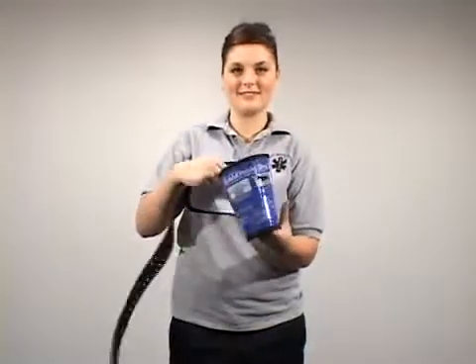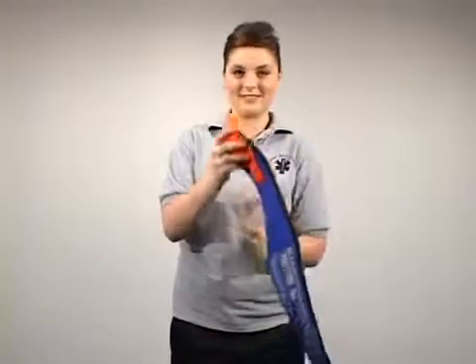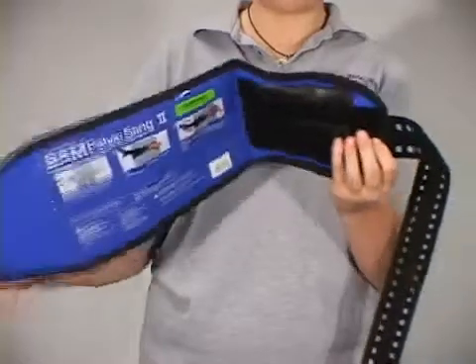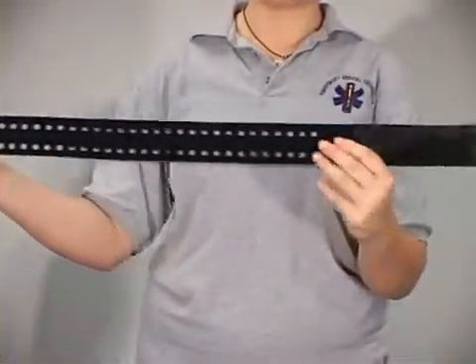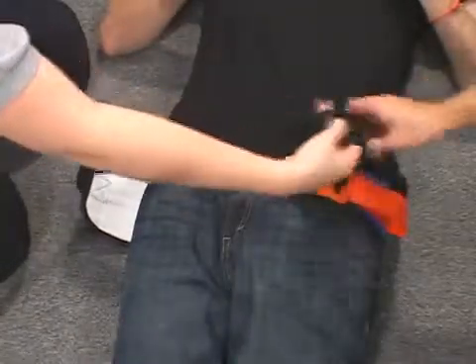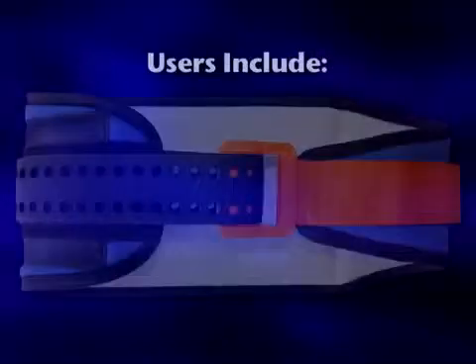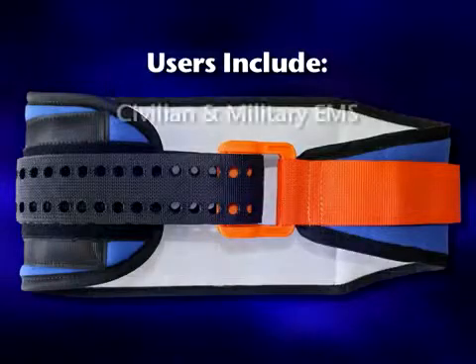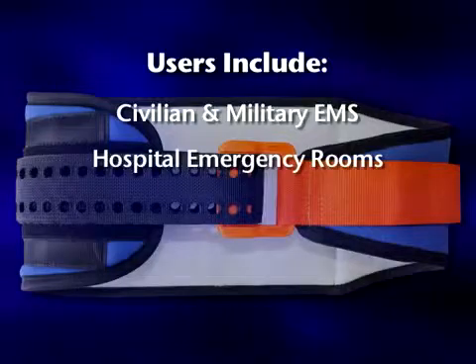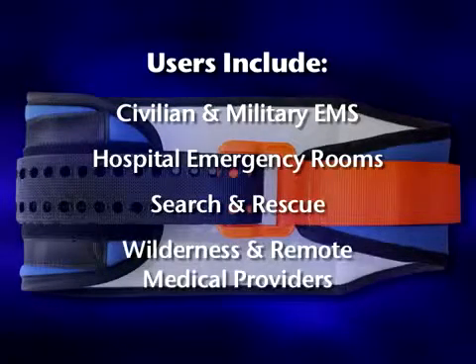The SAM Pelvic Sling 2 — its new one-piece design is easy to use, with application now in just three basic steps. The SAM Pelvic Sling 2 is the first and only force-controlled circumferential pelvic belt designed to provide safe and effective reduction and stabilization of pelvic fractures. Users include both civilian and military emergency medical services, hospital emergency departments, search and rescue personnel, and wilderness and remote medical providers.